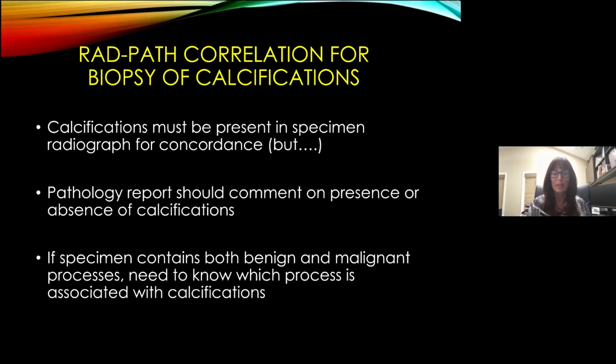On the flip side, if you haven't gotten the calcifications, but your diagnosis is cancer, then you don't need to repeat the biopsy. There are cases of non-calcified DCIS. We know that the extent of disease is larger than the mammographic representation. So in a positive case, it may be acceptable not to have seen the calcifications in the specimen radiograph. The pathologist should comment on the presence or absence of calcifications if calcification was the target of the biopsy.